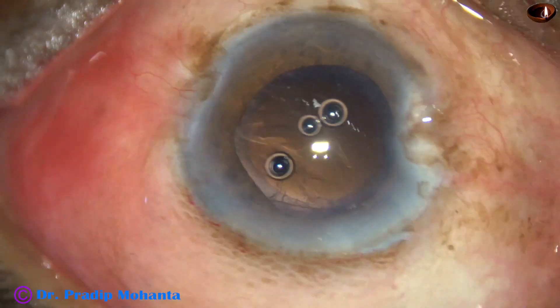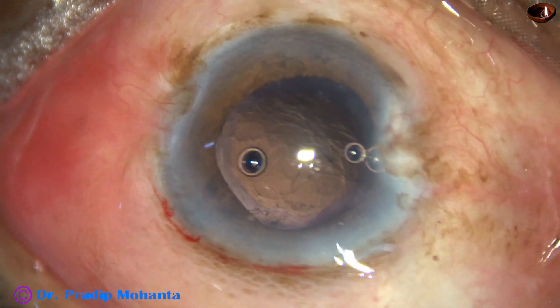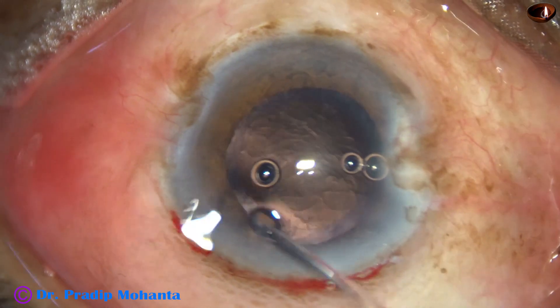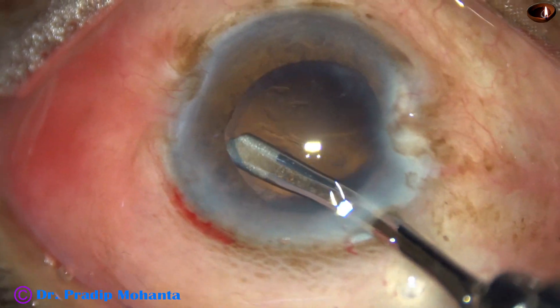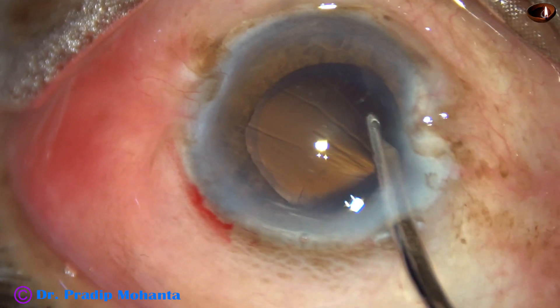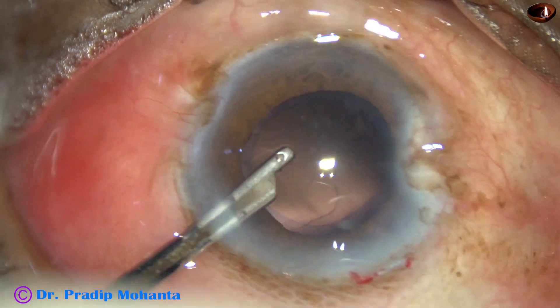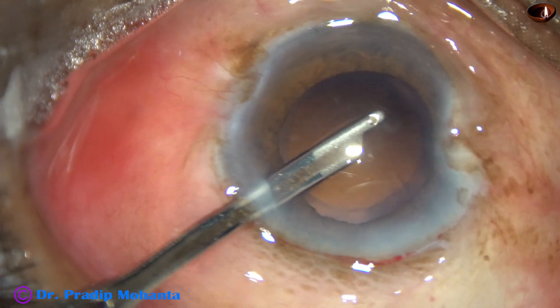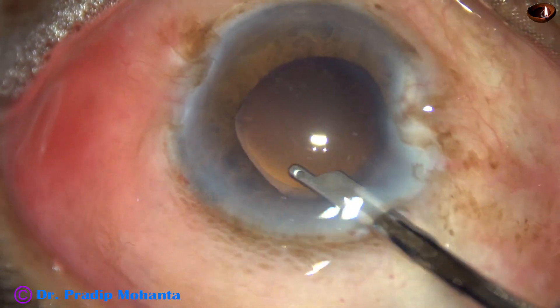Yes, it is done. The remaining cortex is now removed. This is a 23-gauge Simcoe. I go through the side port and remove the cortex from the other side. There is very mild floppiness of the iris in this case.